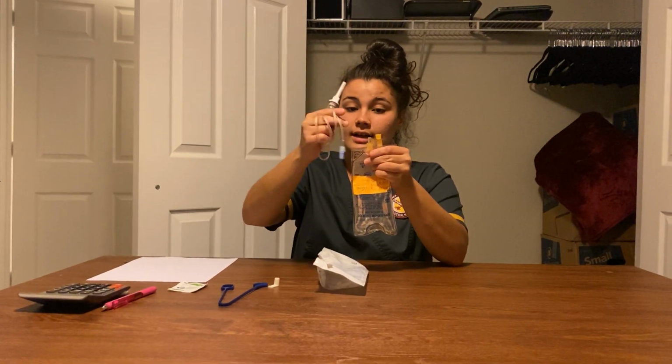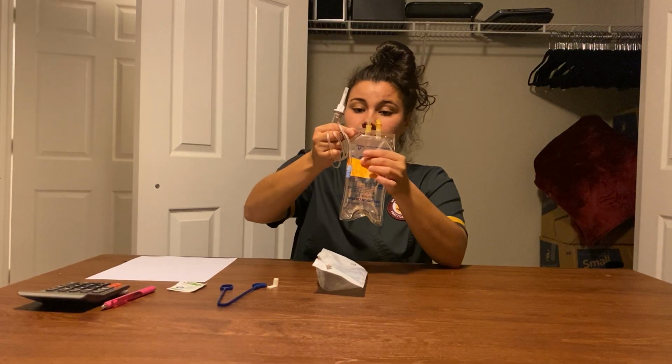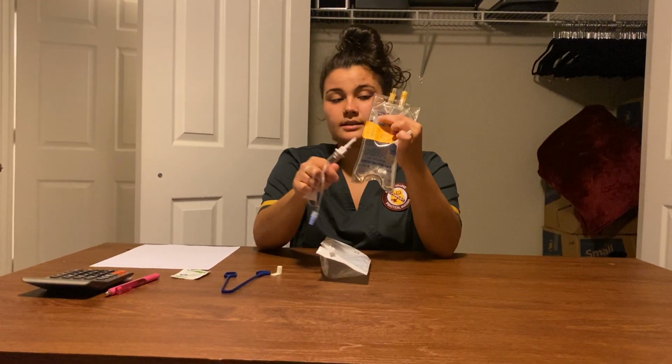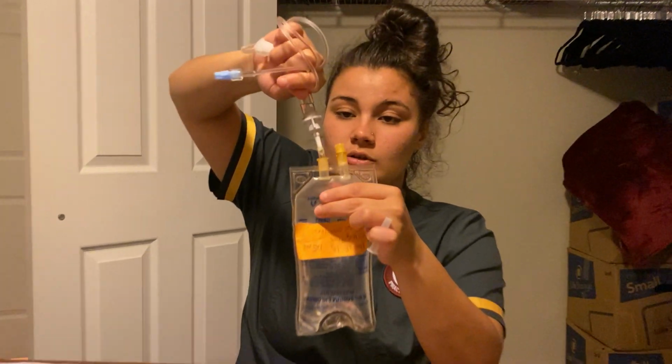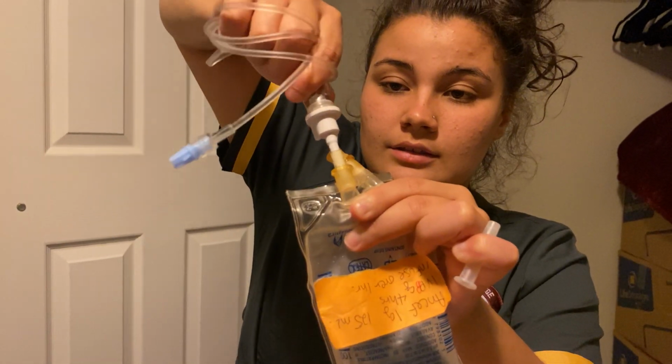Make sure not to touch that top. So I'm going to hold it down here. I'm going to take this off. I'm going to spike my tubing. I'm going to twist it all the way in there to the rim.